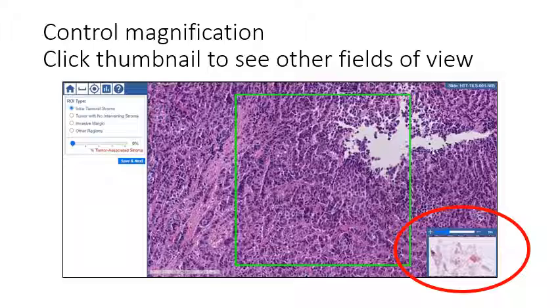The bottom right corner holds the thumbnail of the entire whole slide image and the slider bar that shows and controls image magnification. Clicking on the thumbnail will move the field of view to that location.